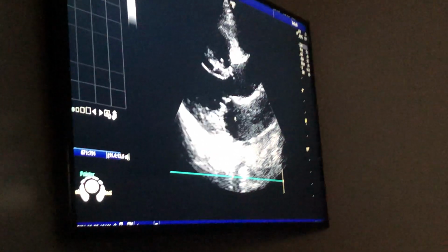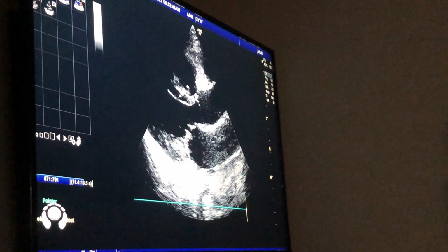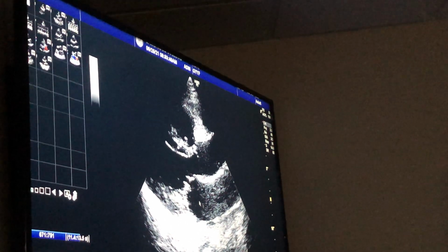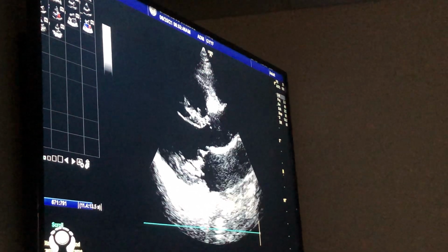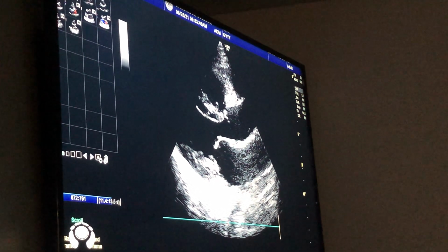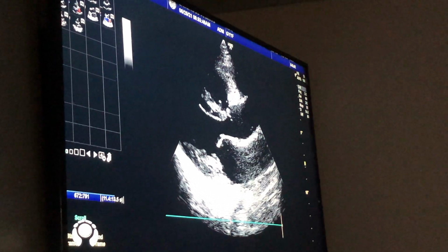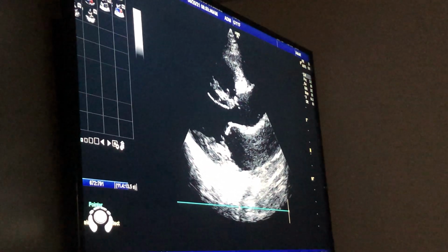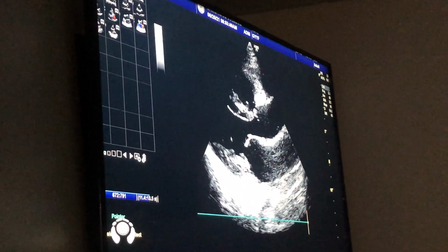Okay, so we're starting here. In end systole, this blood is what we're following. So, I'm now gonna, the valve opens, right? From the minute it opens, diastole has started, okay? As in the blood is now leaving the left atrium, heading to the left ventricle. We're good so far, yes?